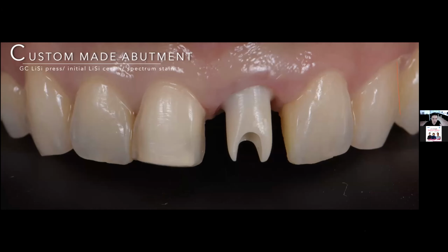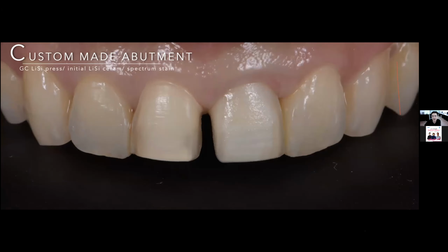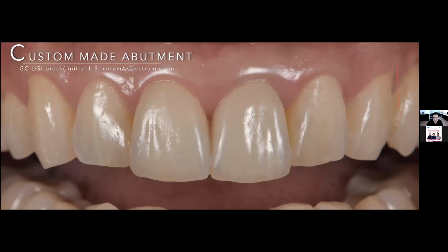When the dentist wants to finish it in the patient's mouth, he sets the zirconia abutment first, the inner core second, and finishes the two layering veneers in the patient's mouth. So this is very easy, and we can see the margin line and the tissue level are very similar, and you cannot easily discover which is the implant.